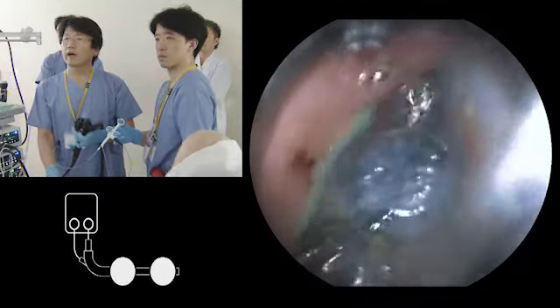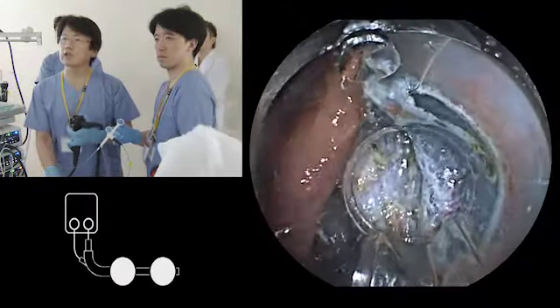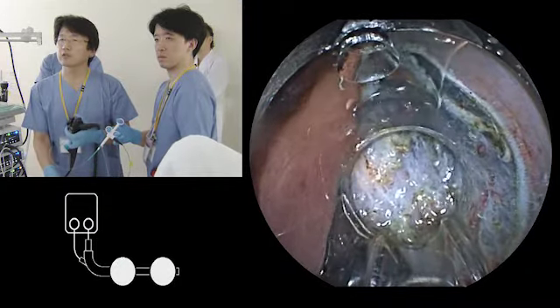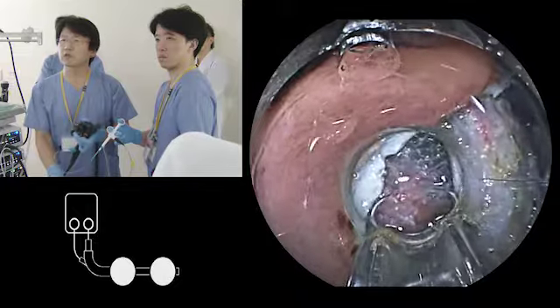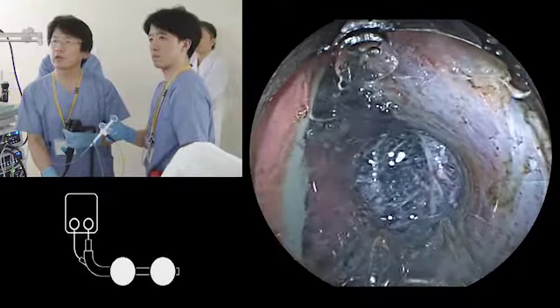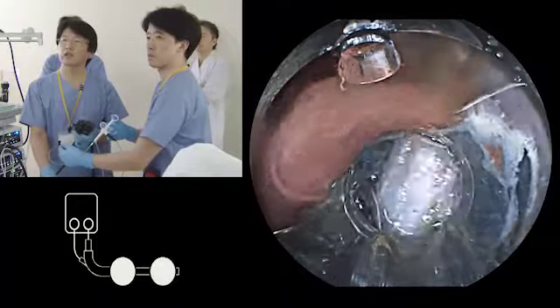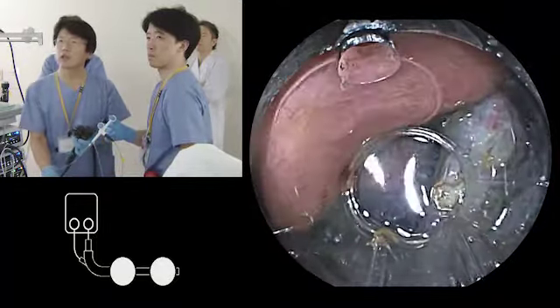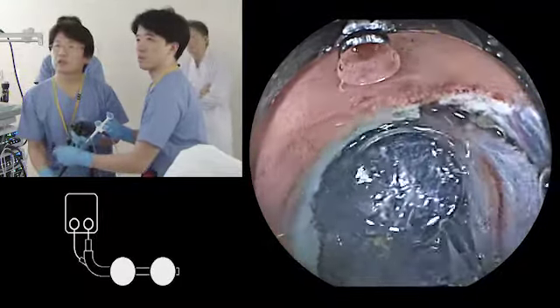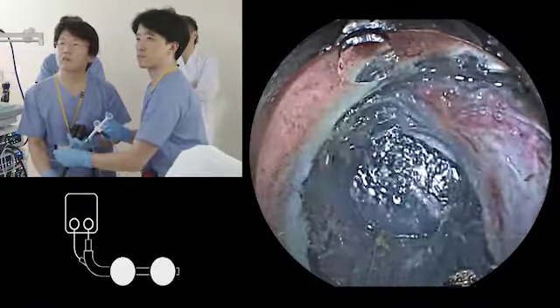Anyway, I made a pocket, and this is the pocket I created, and this is the fold I had shown at the beginning. Using the pocket creation method, I could go up the fold and then press down the fold this way, so I can dissect this way. And even to the right side on the fold, if you go in the pocket, then you can go like this and make a dissection on the fold.